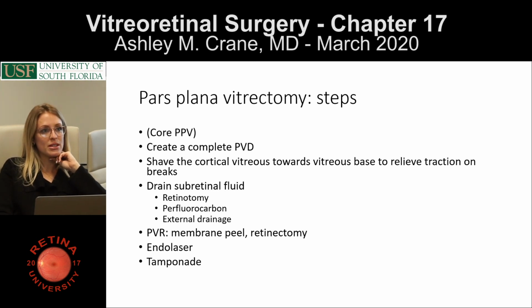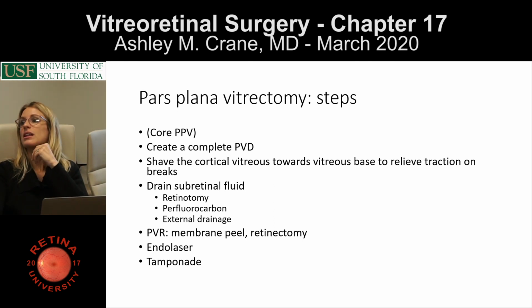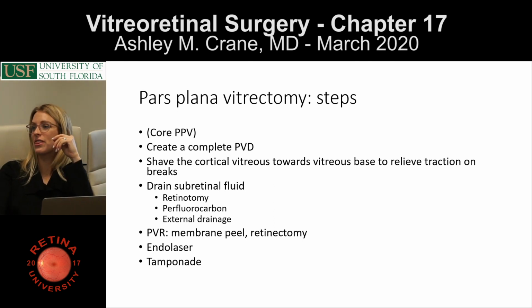Okay. So what's the step in between your peripheral vitrectomy and your laser? Do you guys know what that step might be? This is a step that I was just saying earlier, how it's hard to understand until you are more into it. Well, the hyaloid's lifted because we did the core and we did the peripheral. What were you going to say? Like look at air? Yes, exactly. You have to flatten the retina.